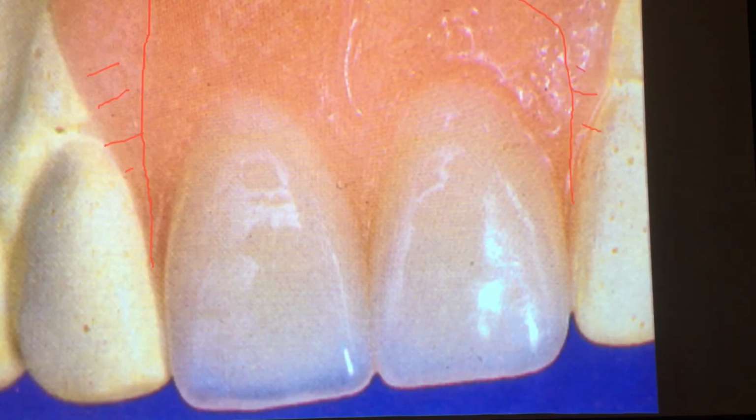So we want to evaluate for aesthetics. If we just put wax in there and say, yeah, it looks great, that's not a finished product. We need to evaluate aesthetics, because once this guide surface is in there, we might end up with this kind of unsightly dark holes distal to the centrals here. So then we need to minimize that either by changing the path of insertion if we can, or asking for some restorative procedures, which is another reason for surveying coming up, where we will ask the practitioner possibly if they could shave down the abutment teeth or the guide planes of 1, 2, and 2, 2.